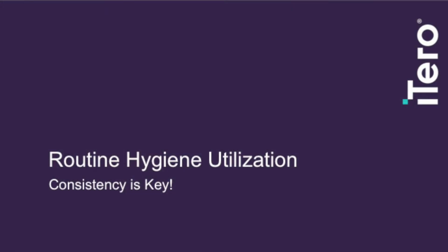During a routine hygiene appointment, the dental hygienist will scan the patient prior to the doctor examination. We recommend starting with an attainable number of patients until you perfect the process. First, 2 patients per day, then all new patients, eventually progressing into scanning every patient that comes through hygiene. Work with your Invisalign consultant to help put these processes into place.